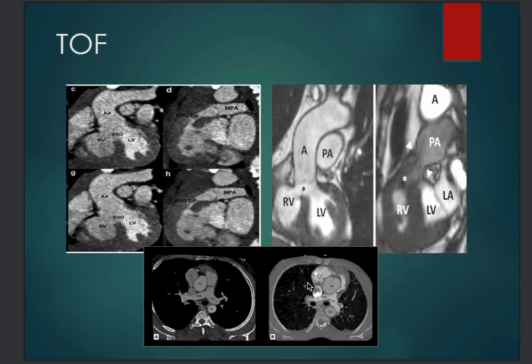This is the fourth lecture in congenital heart defects, and today's topic is around the Fallot congenital heart defect, and it's one of the very common scenarios that we encounter in radiology, cross-sectional imaging, whether CT or MRI.